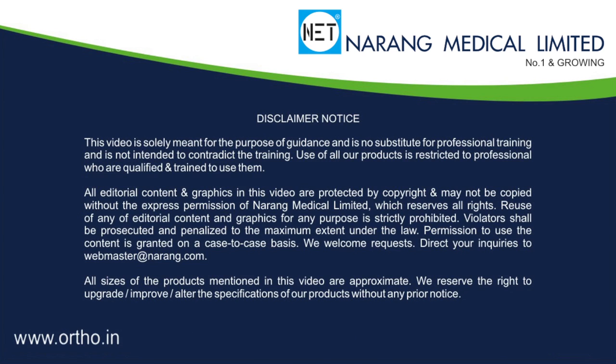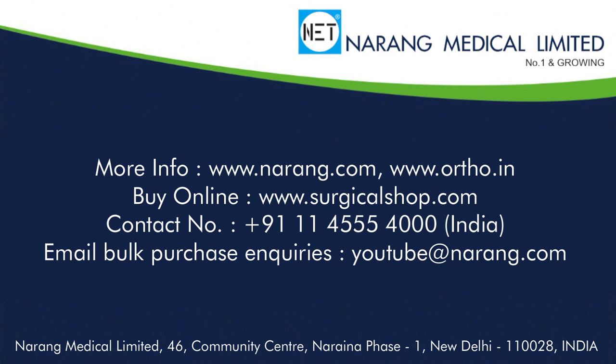For more information, you may log on to www.narang.com or www.ortho.in or www.narangmedical.com.